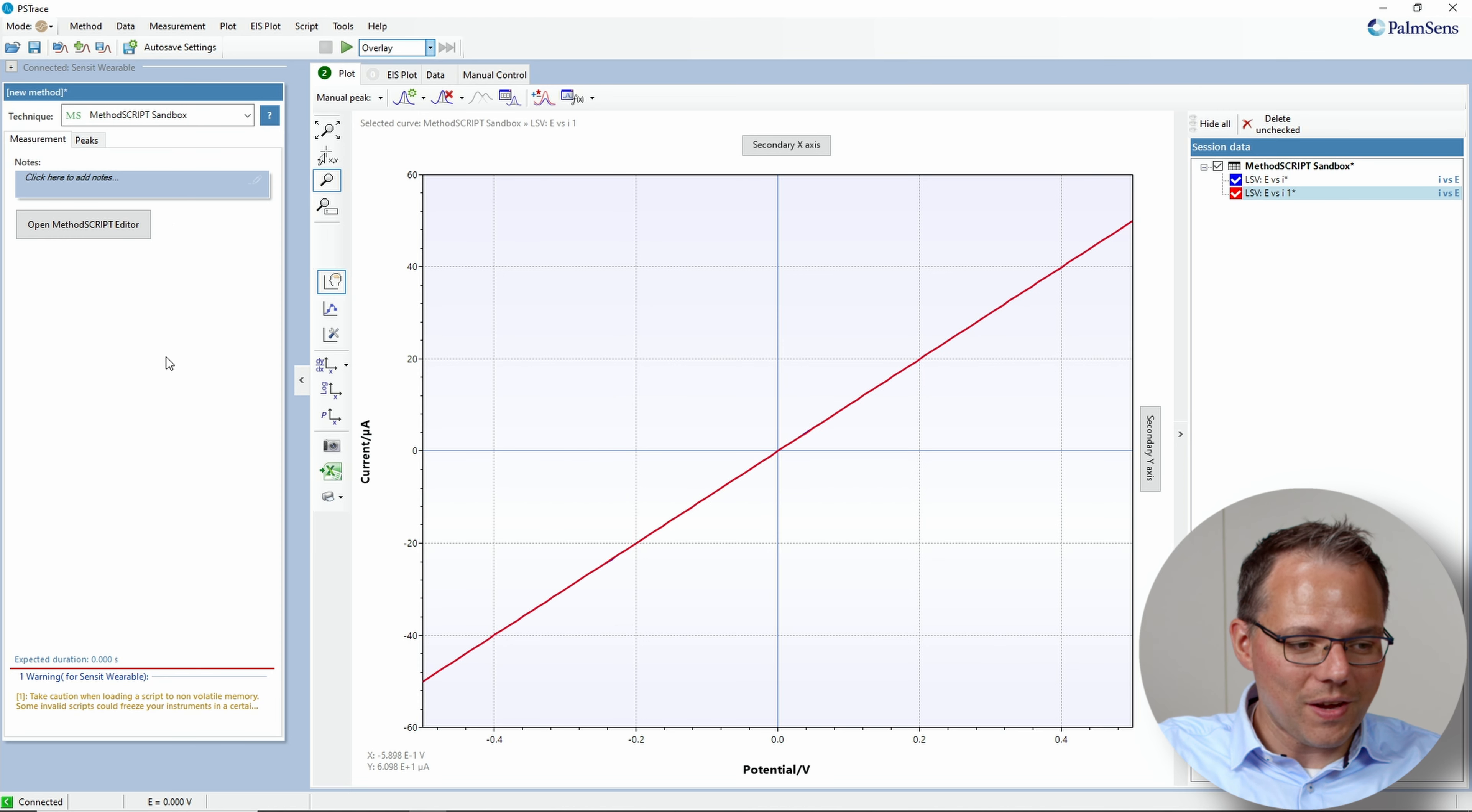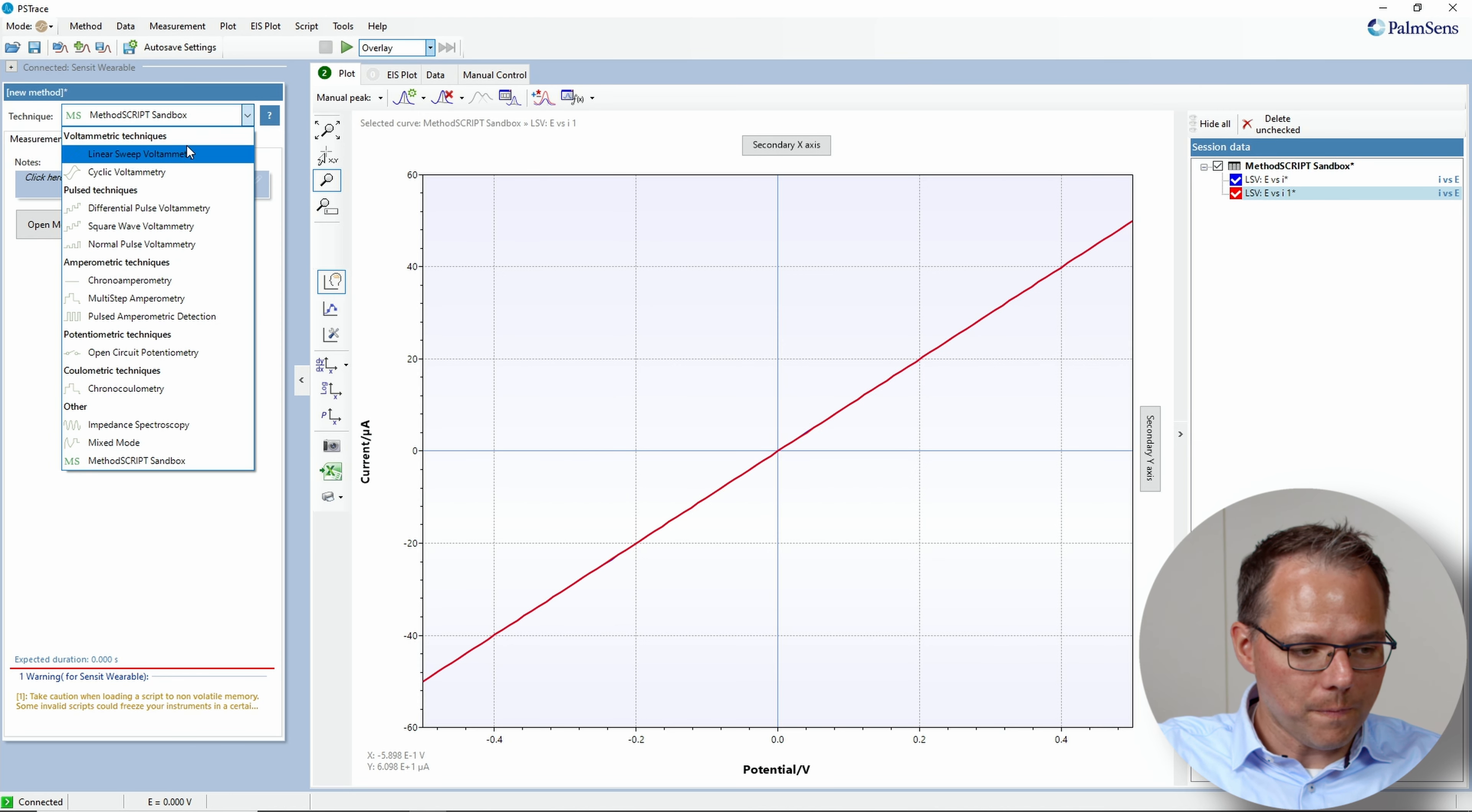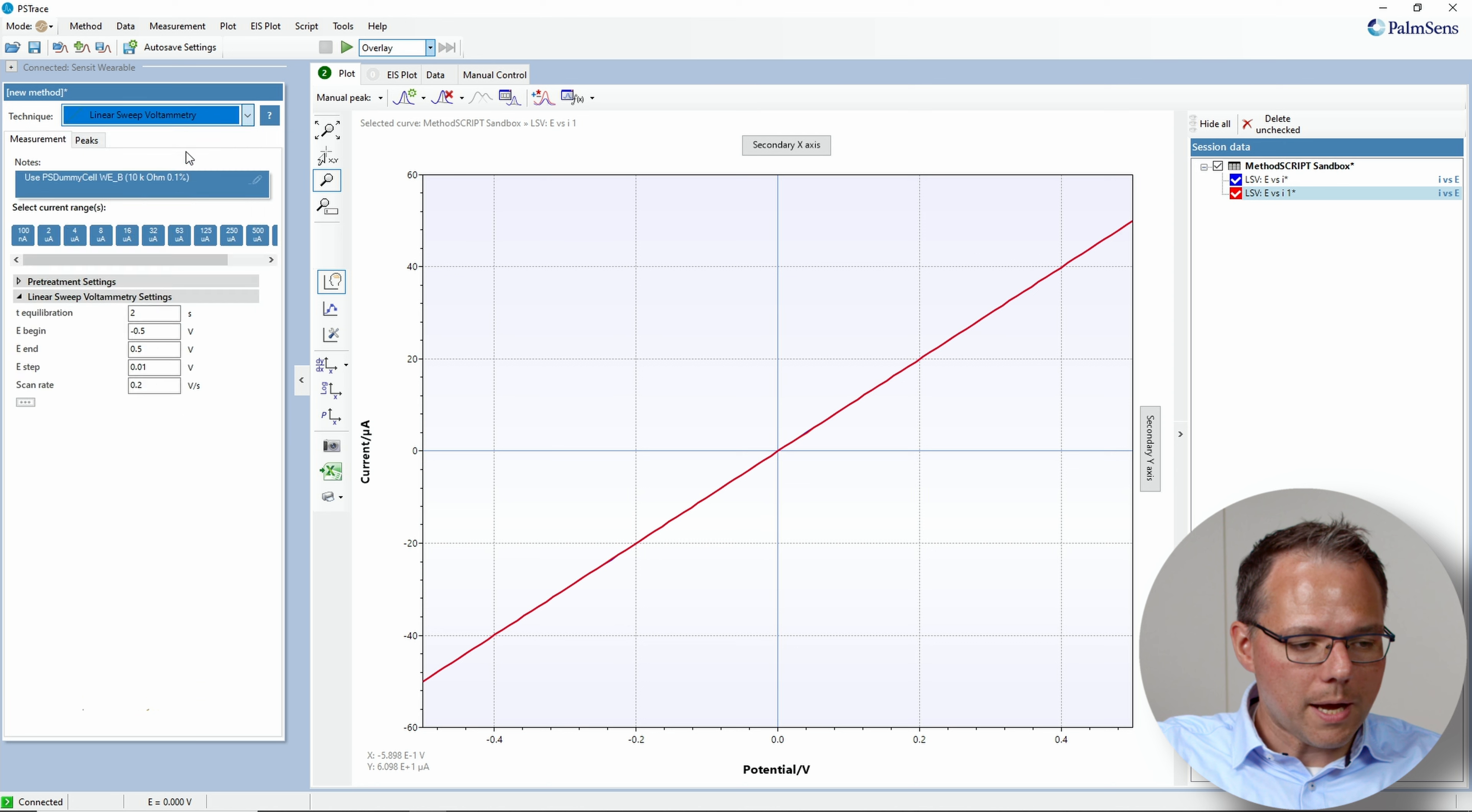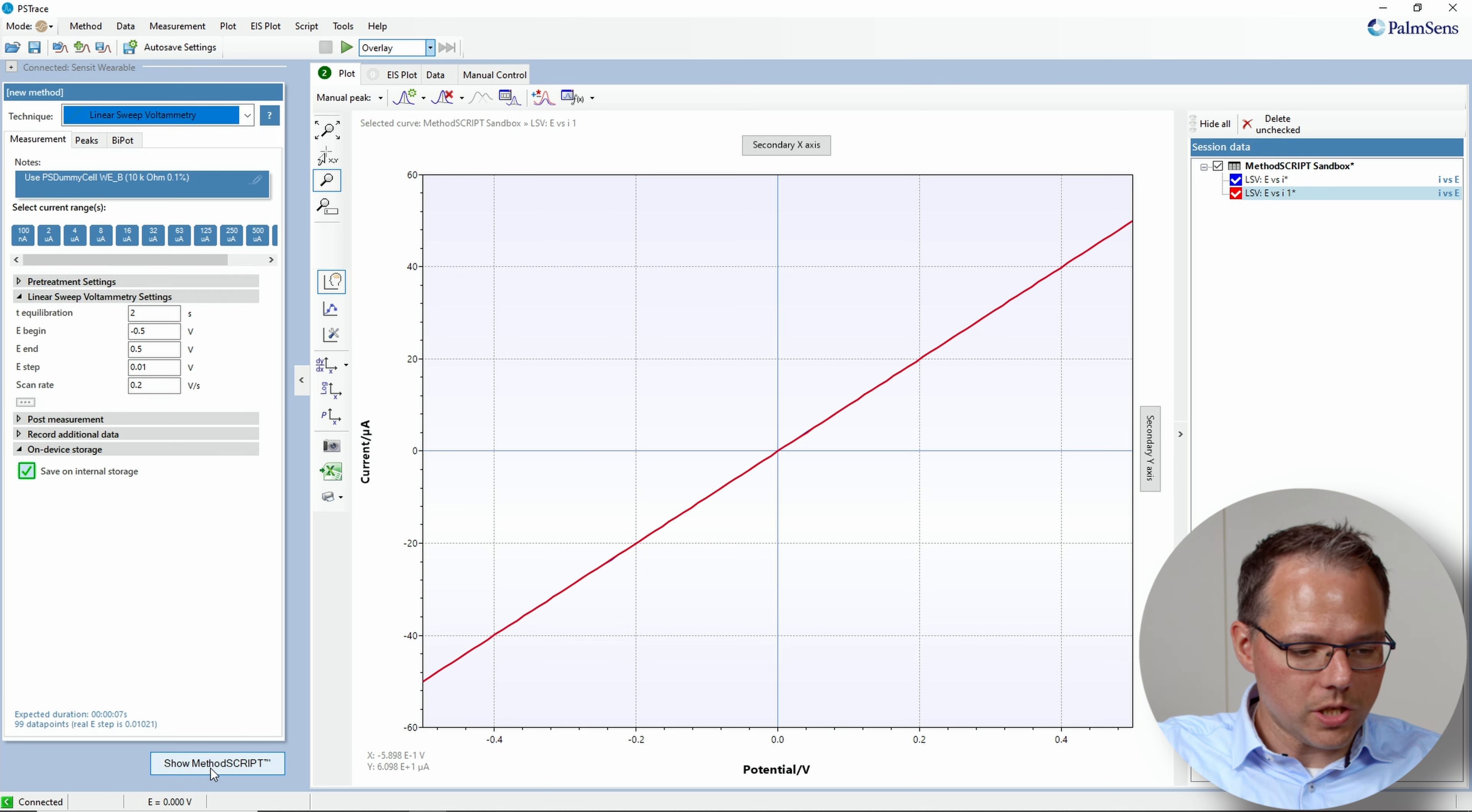I can also show you another way how to activate it. It's very similar to what you just saw. So this is an extra feature.